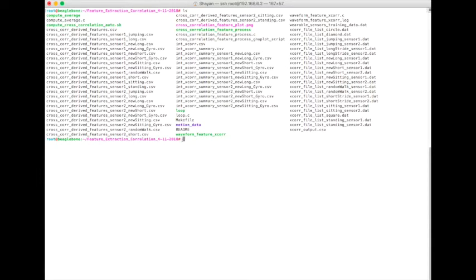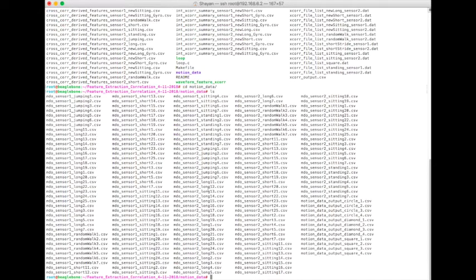Now, the motion data output files have to be moved to the motion data directory. And here are the files: motion data output sensor 1, long strides 1 through 25, short strides 1 through 25, and sitting motion 1 through 25, and that includes sensor 1 and sensor 2. Now, because we used to have more motion data output files, the other ones that you may see here are from the previous trials.